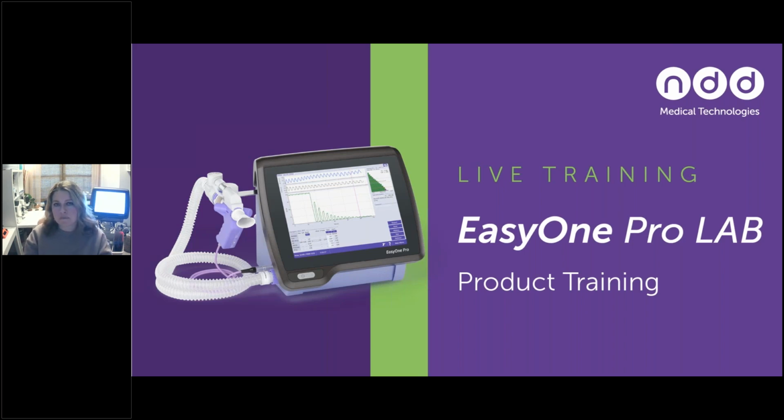Going back to oxygen, is there any suggestion on taking care of patients on oxygen, nasal cannula 3 liters per minute during MBW? This is something you really do need to discuss with the physicians who are ordering the test. If the patient is on a baseline 3 liters all of the time, they can't come off. That's normally the determination.